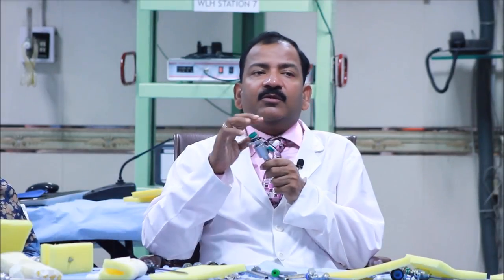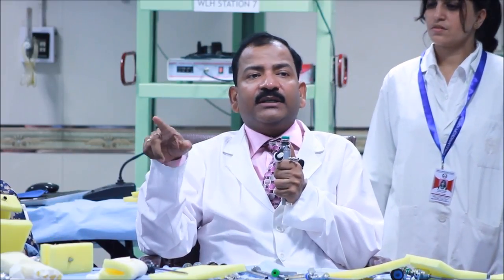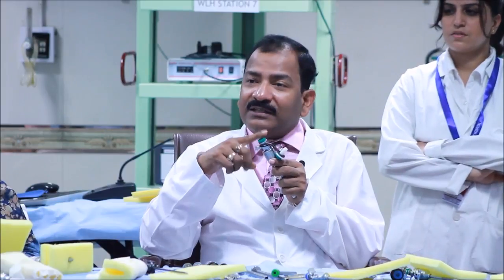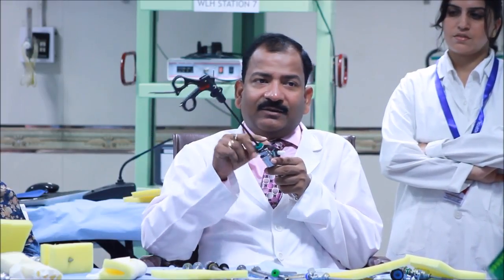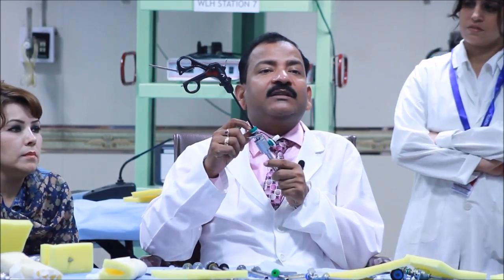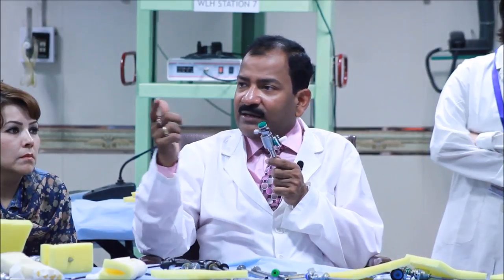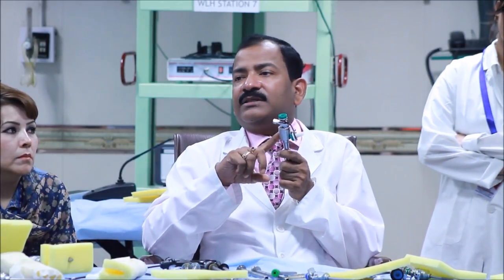Do you know, you remove the instrument. After removing the instrument from any port, if the gas is leaking, that means the valve is defective. And if the gas is leaking after putting the instrument in, that means the washer is defective. Because if the instrument is in, then there is no role of the valve, as the valve is open anyway. So at that time gas is protected by the washer. So after instrument insertion, if the abdomen is deflating, the washer is defective. And once the instrument is not there, the washer doesn't have any role and the gas is protected by the valve. So without the instrument, if the abdomen is deflating, the valve is defective.